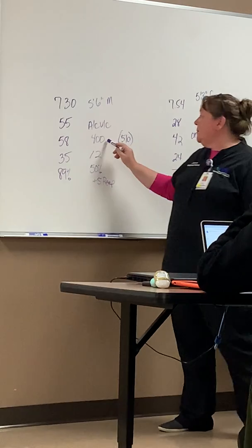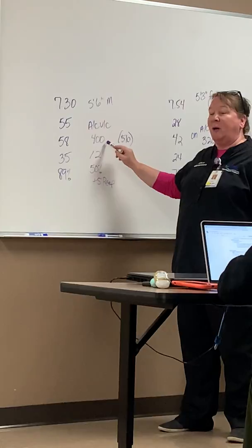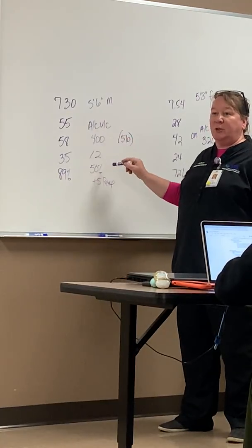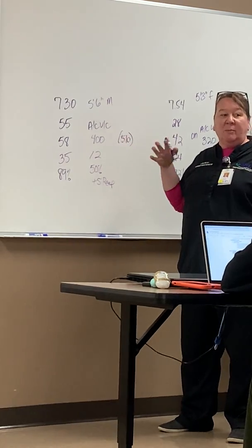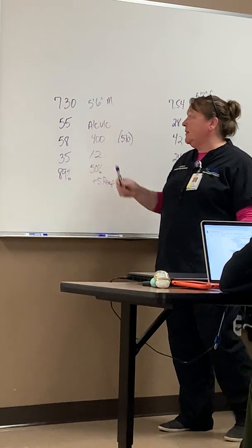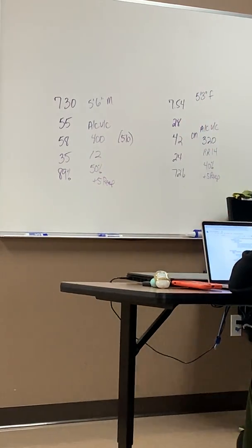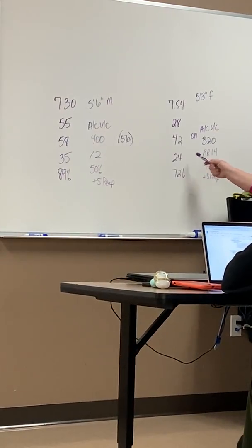So if my tidal volume was at 500 here, I wouldn't have any room to move my tidal volume, so I would have to change my rate instead. That's all we were looking at. If your tidal volumes for almost everybody are between 350 and the high 400s, you're fine. You have room to go, especially if you're in the middle. So, just to repeat what you said, if the patient's within range, then we can still titrate. Yes, but if they're over the top end of the range, then we have to change something else, like the rate. Okay.